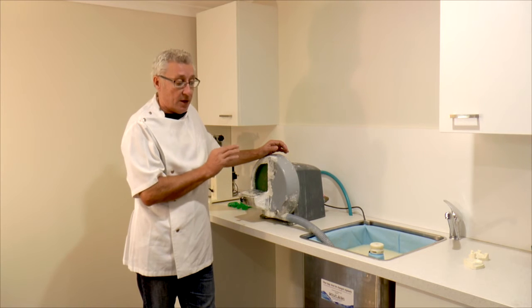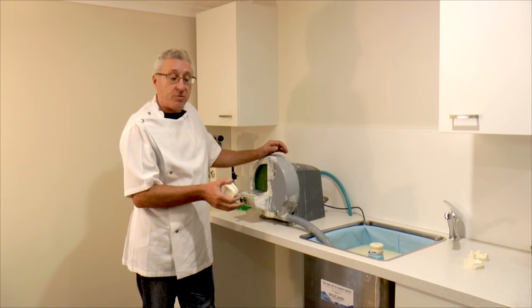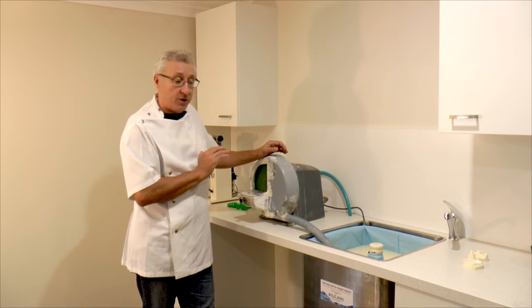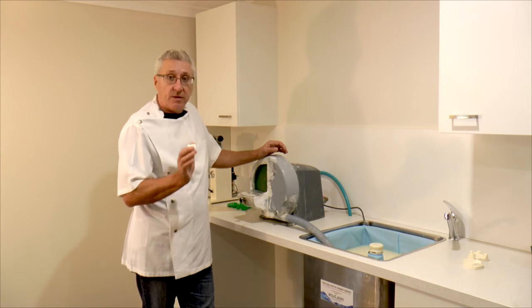So if you have the old school type plaster traps, you're forever trying to unblock them. With this, we can just pull the whole bag out and put it in the bin. No blocked pipes, no smell, easy removal and easy disposal.